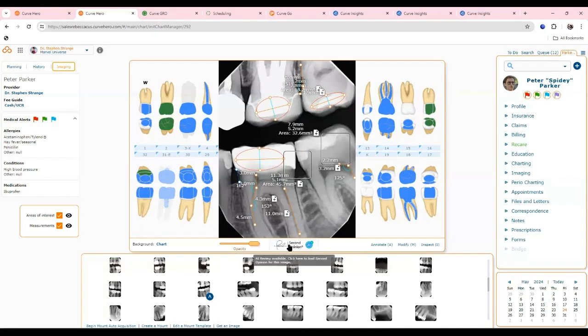There's also an integrated partnership with Perl AI Second Opinion — an AI caries detection system. When you partner with them, a button in the charting area pushes all your images into the Perl Second Opinion system. It's a separate add-on cost — something you choose to add à la carte. It integrates inside Curve to make it easy to toggle between the systems.